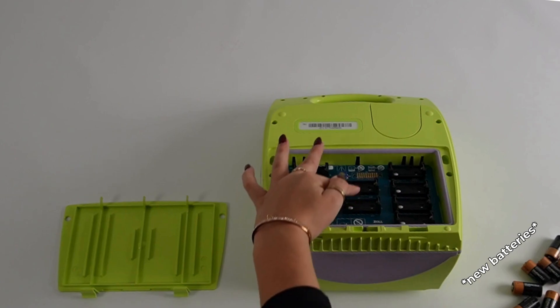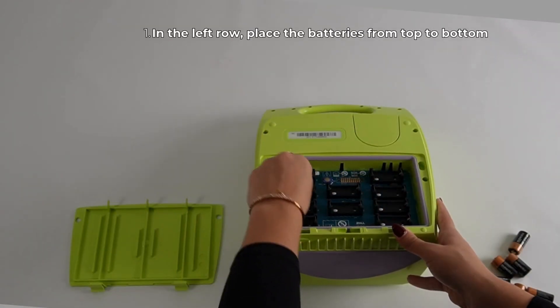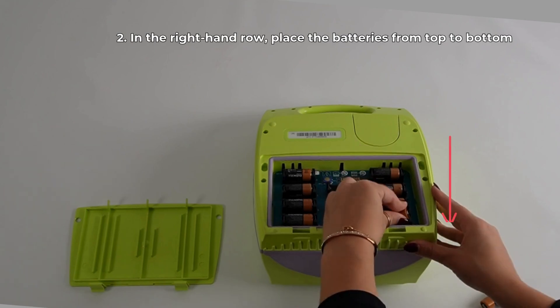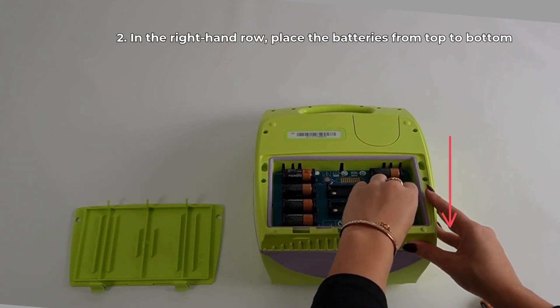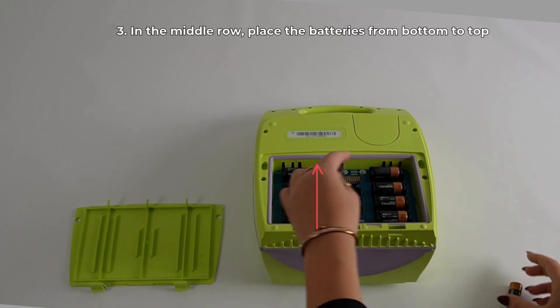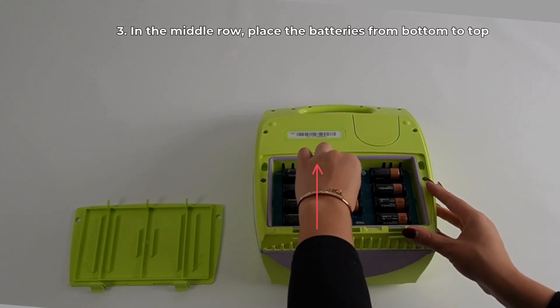There is a sequence for inserting the new batteries. First, in the left row, place the batteries from top to bottom. Then, in the right-hand row, place the batteries from top to bottom. Lastly, in the middle row, place the batteries from bottom to top.